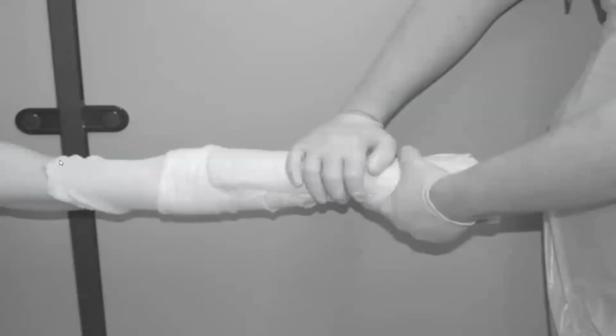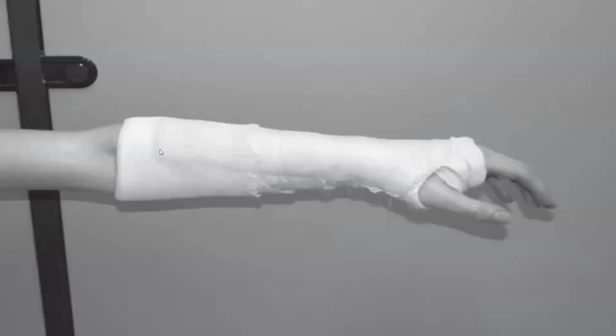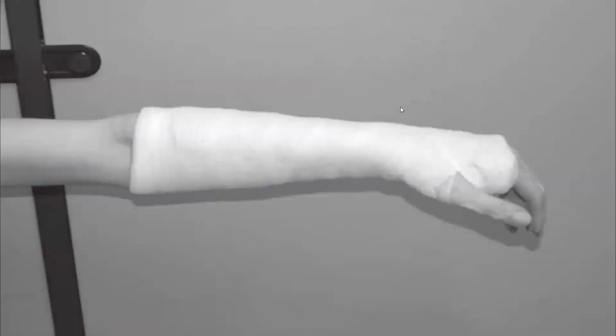So stockinette here, 10 centimeter above and 5 centimeter below. Then you will fold the stockinette here, you will fold the stockinette here, before the stockinette down here, right? Okay, so after that, you will apply crepe bandage. Okay, the last step, like this.